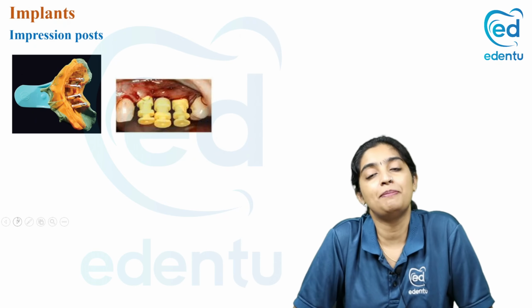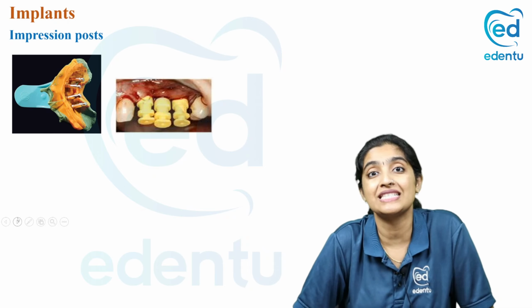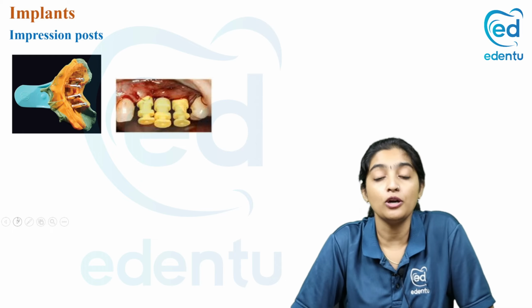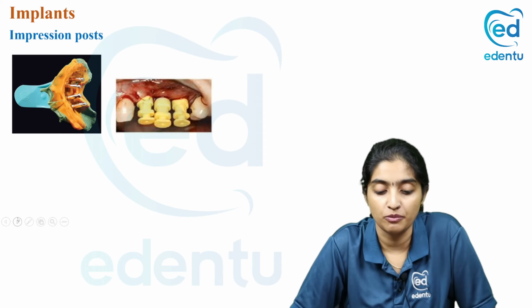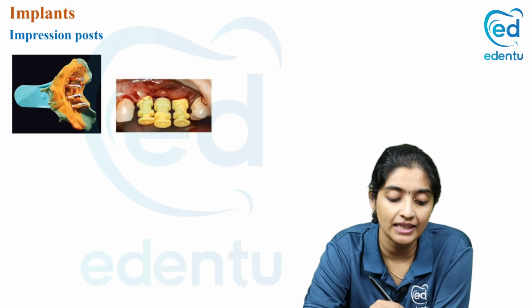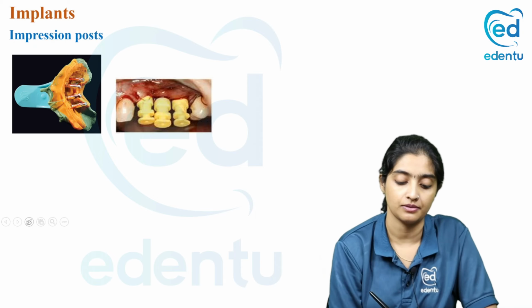It is always best to use a closed tray impression post for single implants, even snap-ons. But for multiple implants or a full mouth case, it is best to use an open tray impression post. Now here you have the impression post and onto that the implant analogs are attached. Okay, and then you pour the cast.